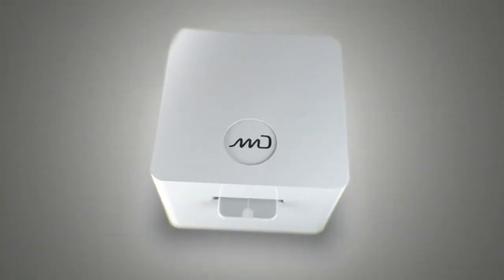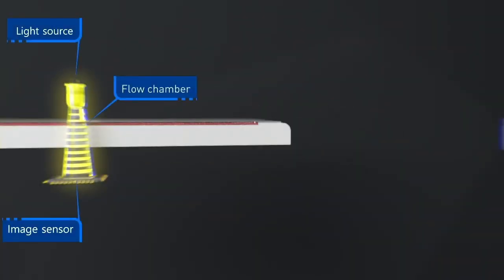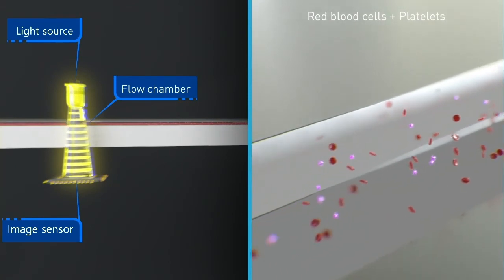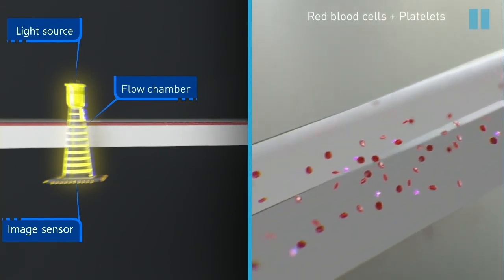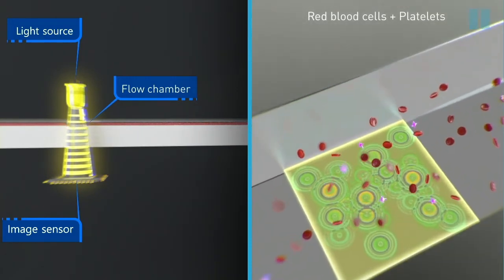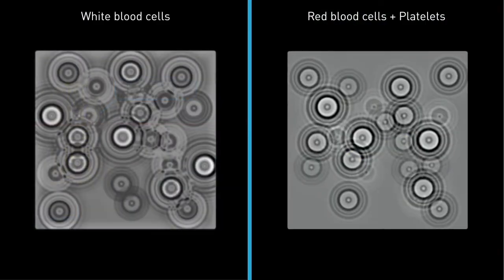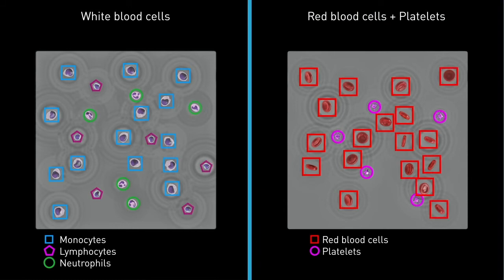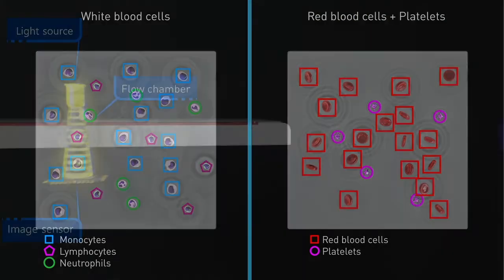For its CBC test, MyDiagnostics uses lens-free imaging, a novel technology that only needs a light source, image sensor and flow chamber. The cells diffract the light that is emitted by the light source, creating holographic images that are reconstructed to allow machine learning techniques to classify different blood cells.